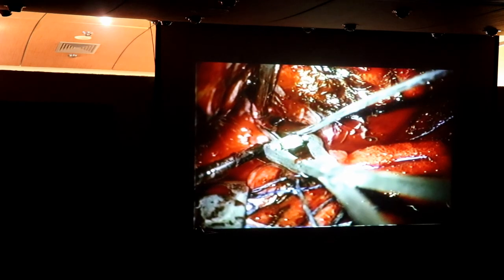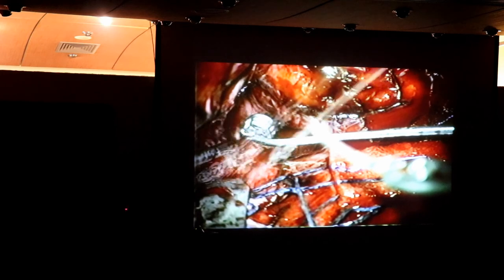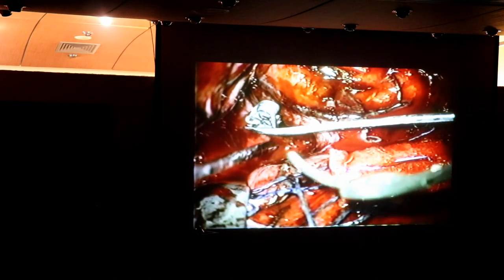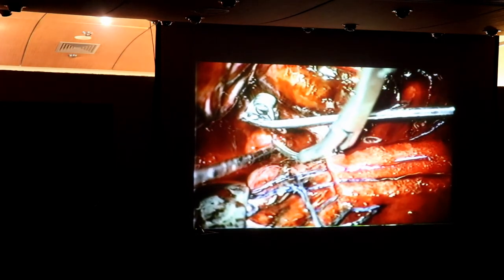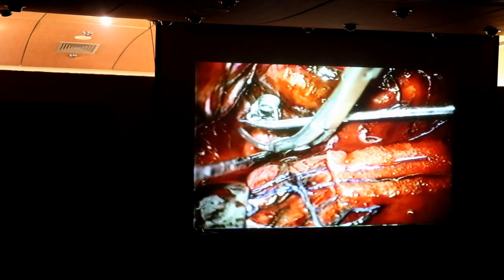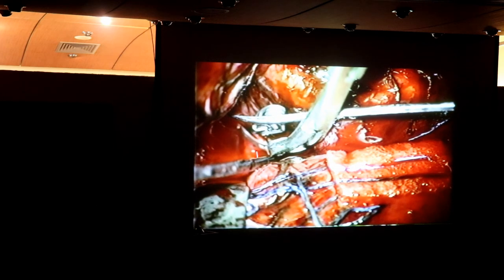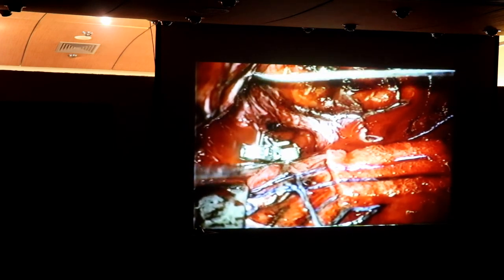But I'm not happy about it, I'm not happy that I really closed the neck of the aneurysm. If I did not close it, this is incomplete clipping, like incomplete coiling, it will rupture again. So I bring another clip, and I adjust it. There's no escape. You don't say, oh, okay, I've secured the aneurysm. You didn't. You have to close the neck properly without closing the parent artery. Now I'm happy.